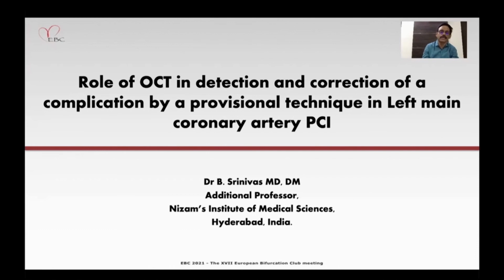Thank you for the invitation to present at the EBC 2021 meeting. The title of my presentation is Role of OCT in Detection and Correction of a Complication by a Provisional Technique in Left Main Coronary Artery PCI.